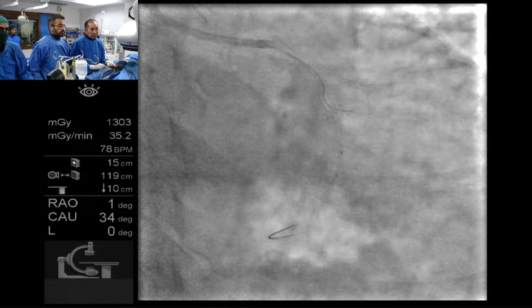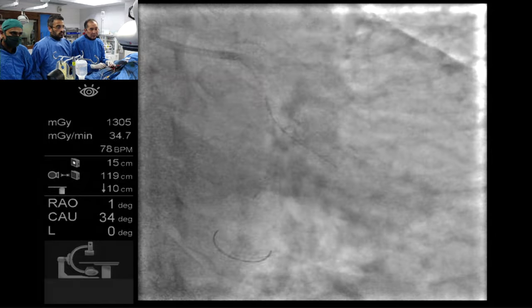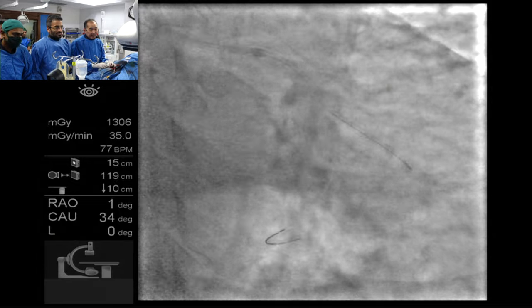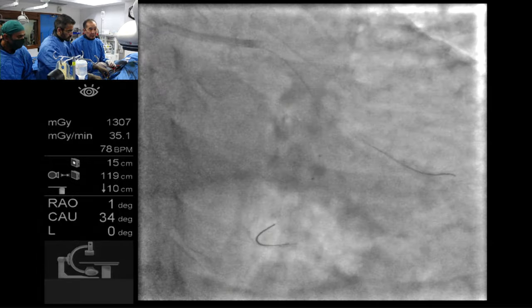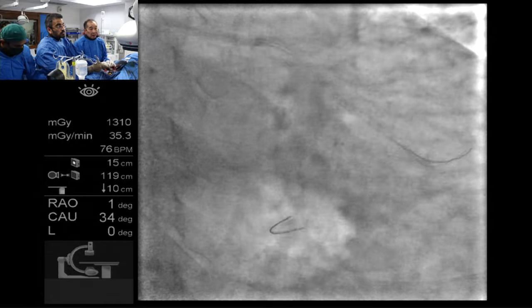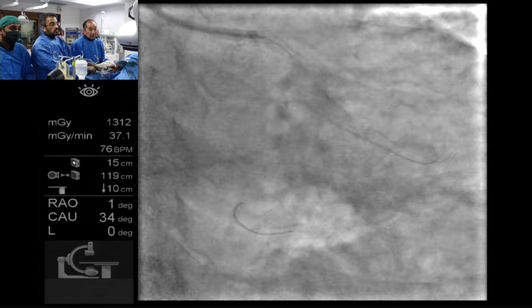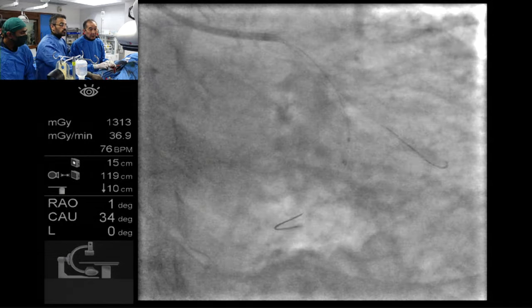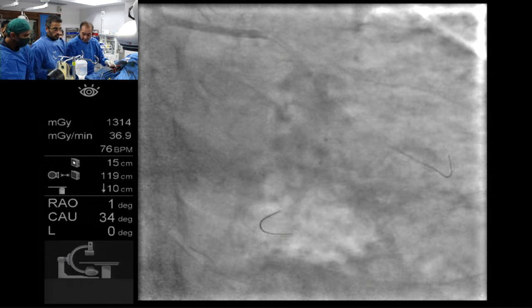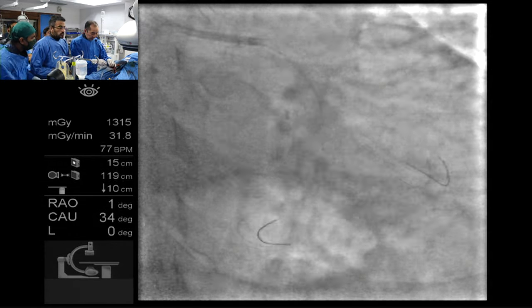Yes, right there. Right there. Take a puff for me. Make sure I'm okay. You're in. It looks nice. You got a nice purchase also, pretty deep. Or distal looks nice. All right, after nitro, everything's good. So can I have the 1.5 balloon here? Oh, already there. Okay, good.